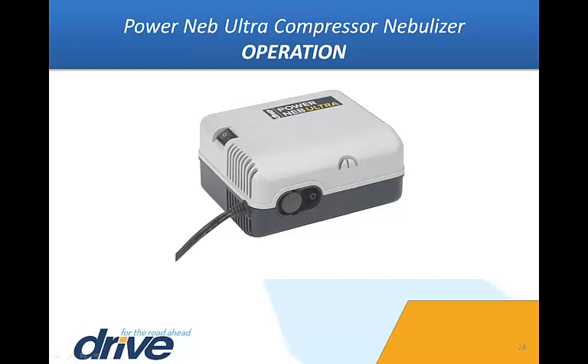When treatment is completed, turn the power switch to the O position and immediately unplug the power nebulizer.